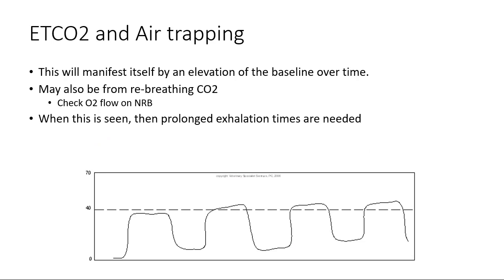So I've talked a lot about your waveform should return to 0 at a baseline. So what happens when it doesn't? And here you have an example of a baseline that's slowly rising. What's happening there? Well, somehow you are trapping CO2, or not trapping, you are rebreathing CO2.